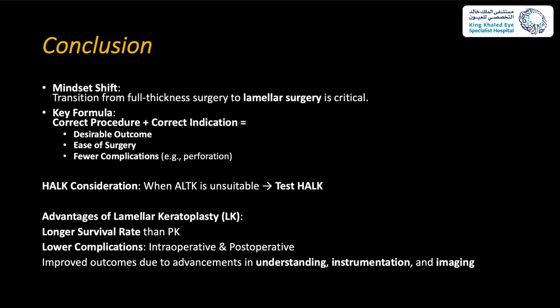Really, I want to thank you for waiting all this time. So basically, lamellar keratoplasty needs a mindset shift. You need to transition from full thickness surgery to lamellar surgery. The key formula is to find the correct procedure for the correct indication to get a desirable outcome, ease of surgery, and fewer complications. Consider ALTK, if not HALK, and then DALK.